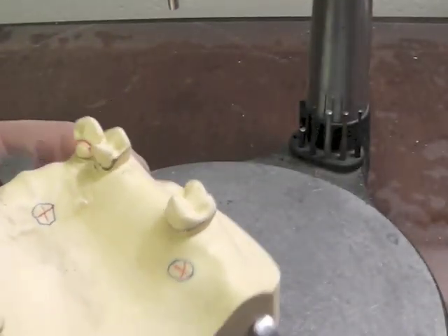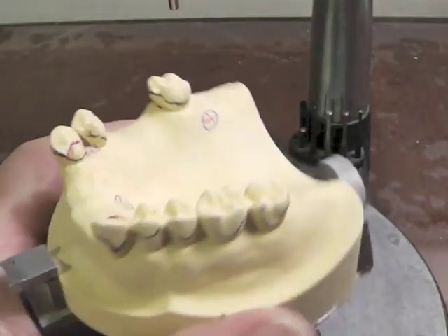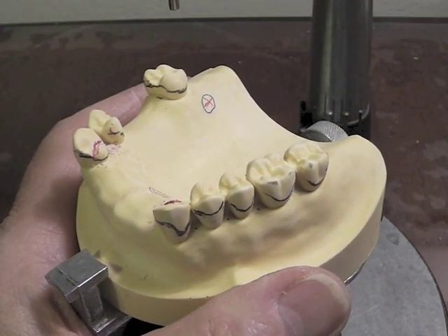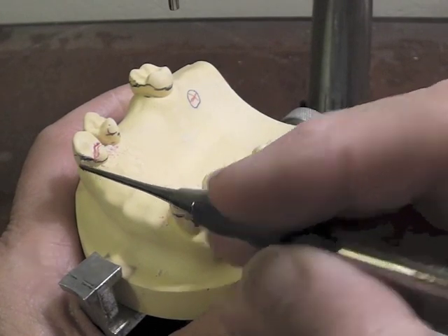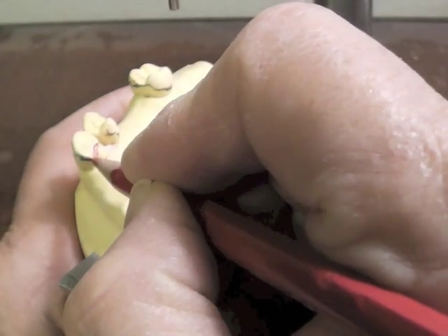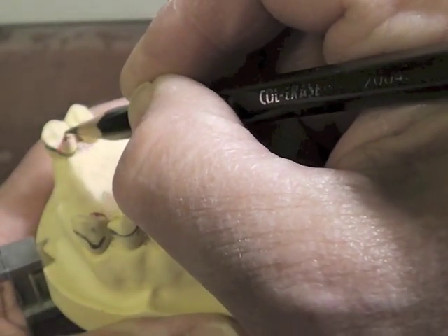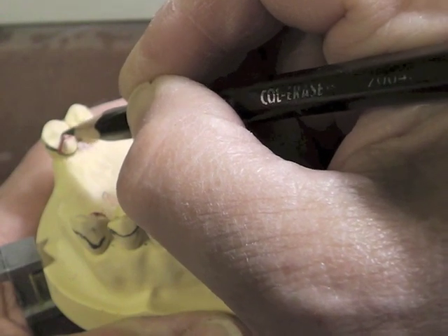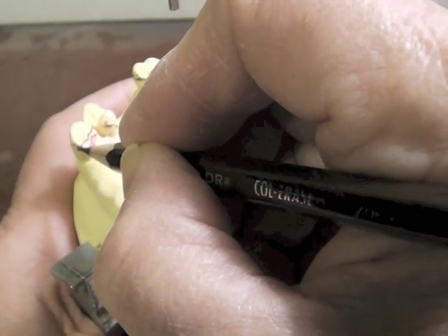It's a nice rounded chevron, and I'm going to go ahead and redraw my rest right here. On the other side, again, I would prepare that rest. Now I'm going to look at these guiding planes because you can see that we have a very high survey line right along here. The guide plate is drawn. We're going to come up, we're going to have our metal across this area, a millimeter or so above my cingulum rest, and it will come down right about here.